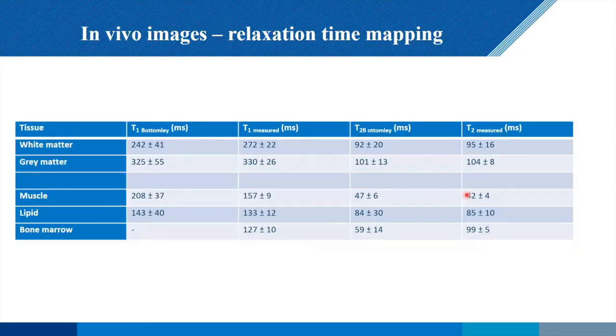And then it's interesting to look at these measured times over here from Tom's work, and to go back to the work from Bottomley in 1981. What we see is many fall certainly within the standard deviation, although there's quite a large standard deviation in Bottomley's work. A couple of things lie outside it, but essentially I think we have a high degree of confidence in the results we get, in the sense that they agree with this and some of the other models that people have come up with.